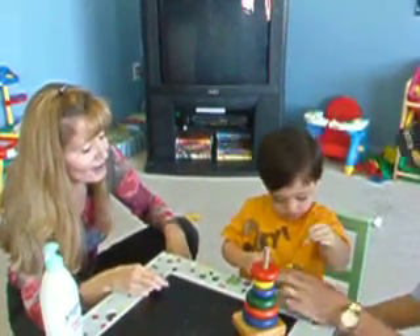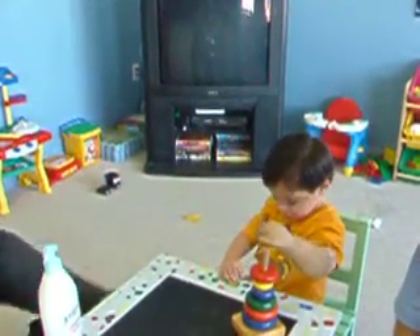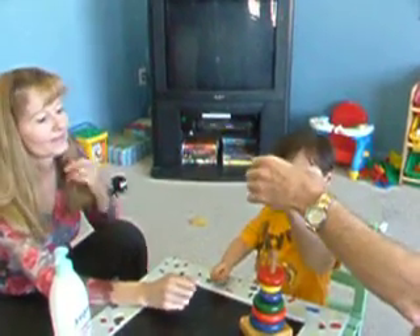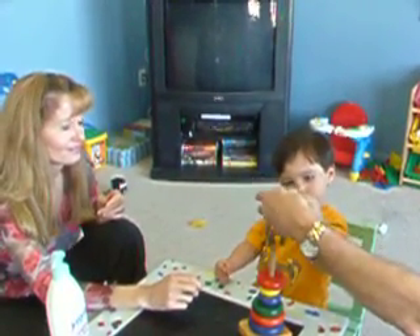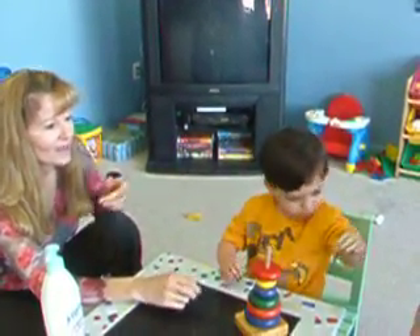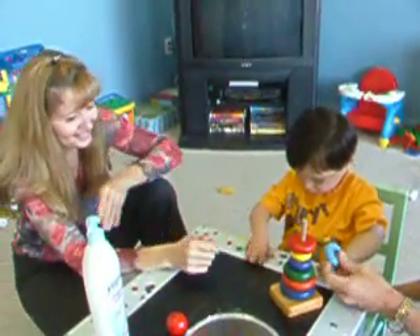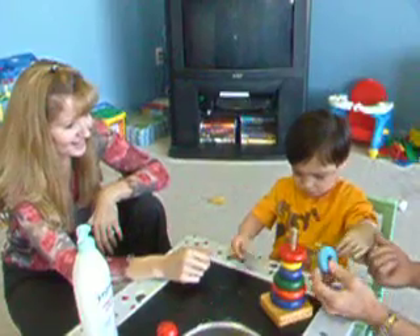Okay, now you got it. Almost. Almost here. I'll get it. You know something? I have that electrode turned up too hard. Here you go. What is it on? Reach up here and get it. Okay. Reach your way up here and get it. Now you go. We have to turn it down. That's okay. That's all right. That's a great job. Try one more time.